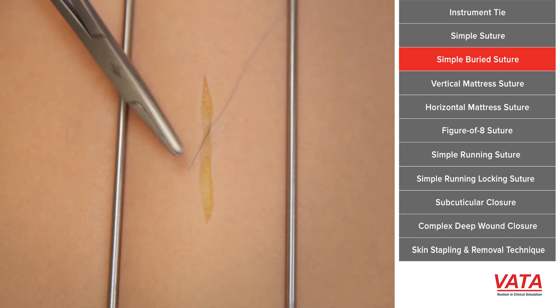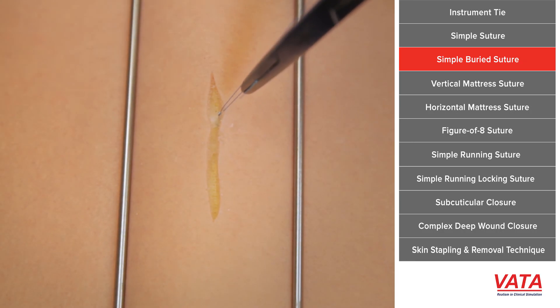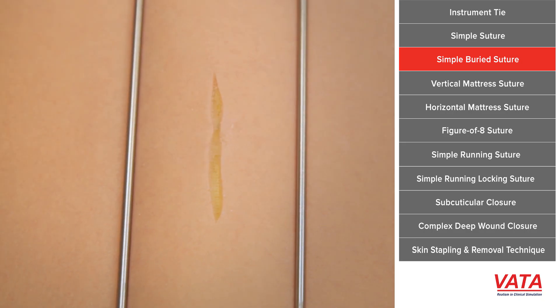Notice also when I'm pulling, oftentimes I'll pull it along the wound. It allows you to get the tie all the way into the wound, and it's not being prevented by the skin edges. So this is a simple buried suture — this is something that we use all the time in plastic surgery.